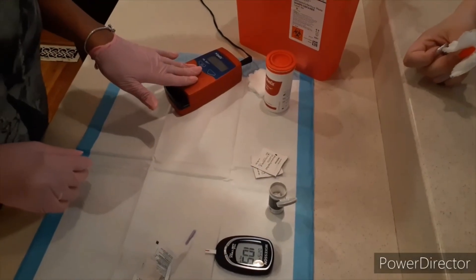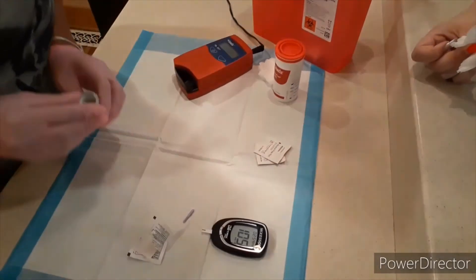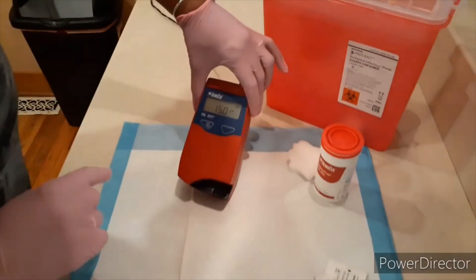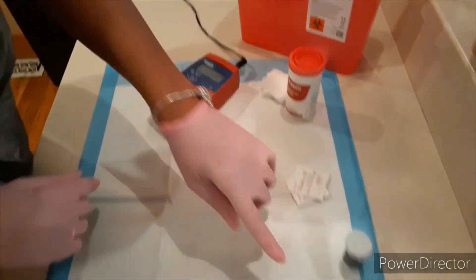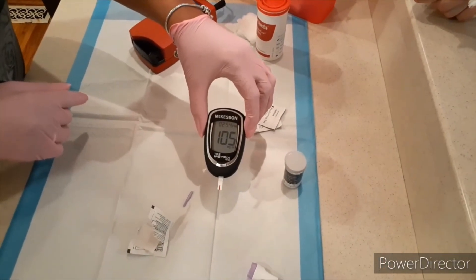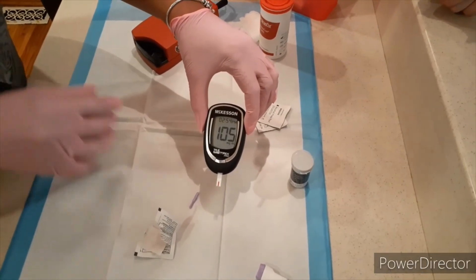This one usually takes about 15 to 60 seconds. We already have our blood sugar results. Our hemocube results are showing a hemoglobin of 15.0 — make sure we document that. We have 105 for our glucose result. We'll document that, and we also want to document whether or not the patient has had anything to eat or drink.